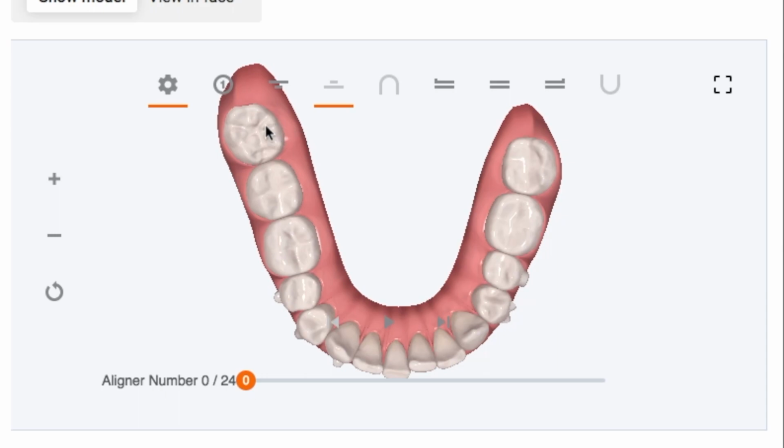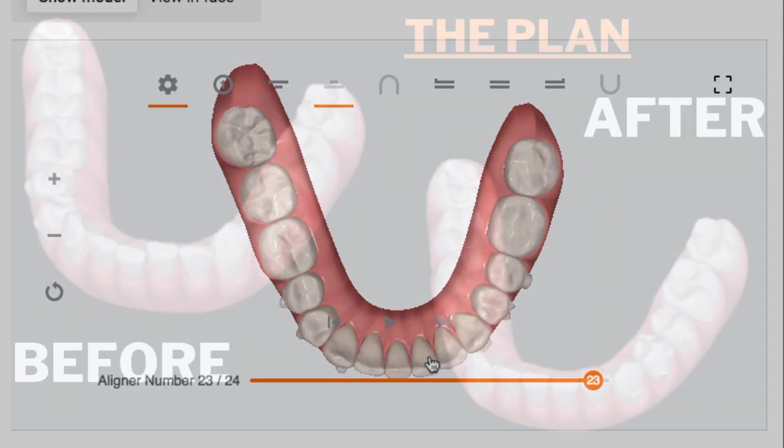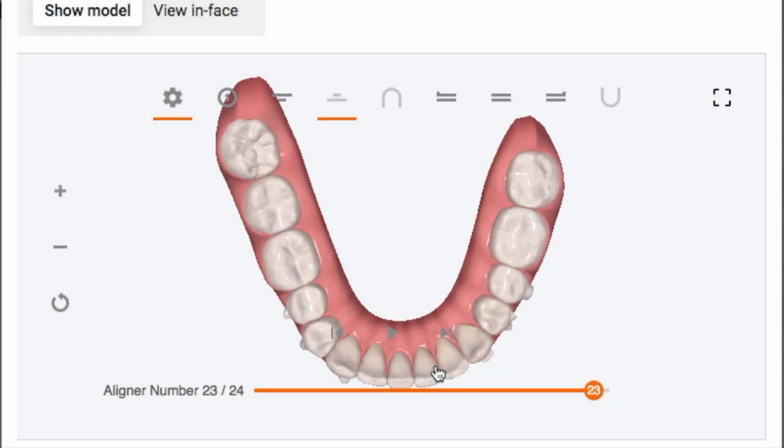After making room for the molars in back, surprise, surprise, there's room for the teeth in front to move into position. I did the tilted view on the lower teeth as well, so you can see just how crowded those front teeth were. And now that I've finished the treatment on the lower teeth, my teeth are now all lined up the way they were supposed to be.